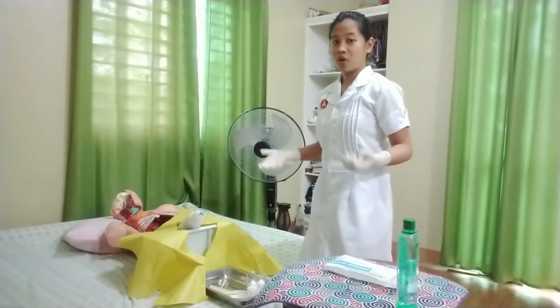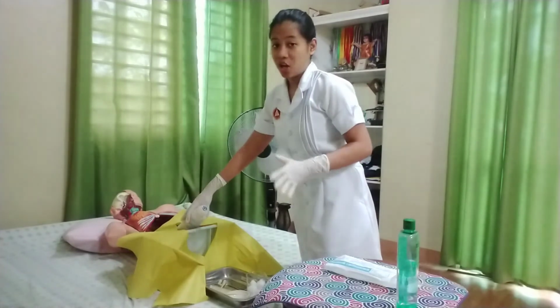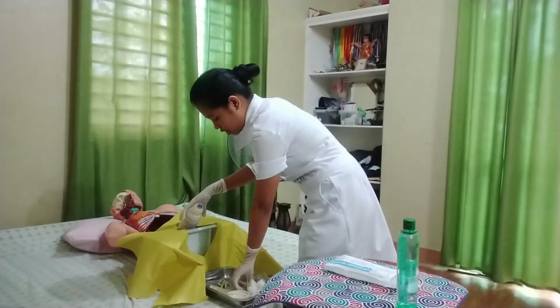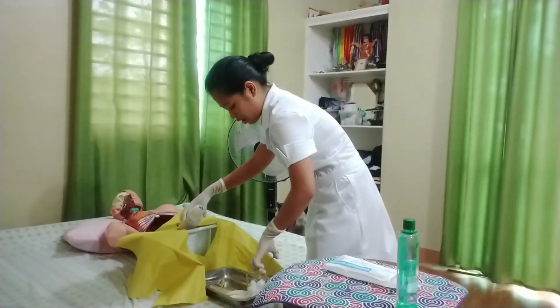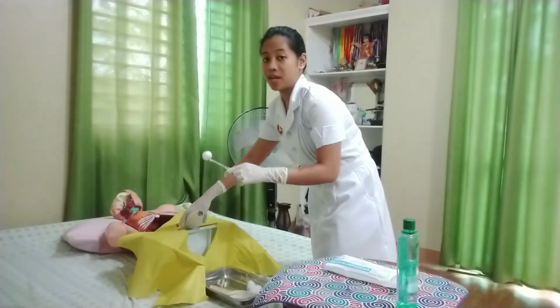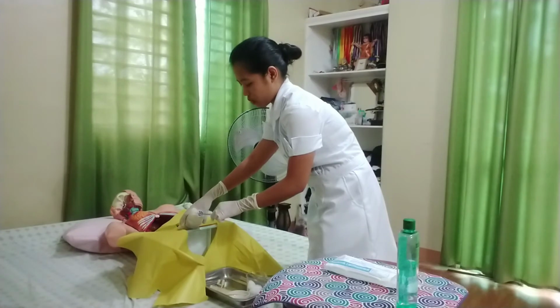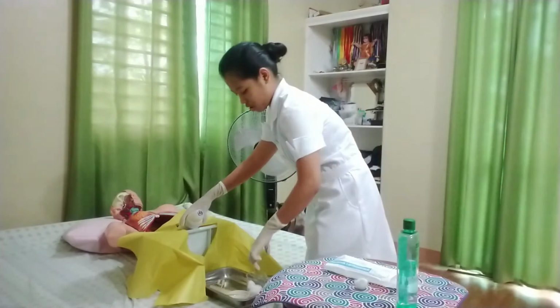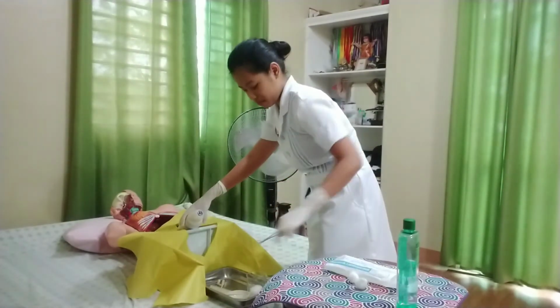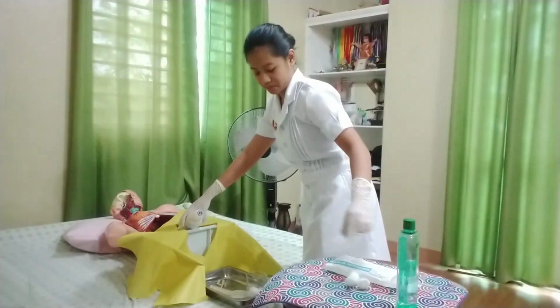Assuming that we've done all the first procedure, I will now lift the penis using my non-dominant hand, which is already considered contaminated, and using a clean cotton ball held by the forceps, I will be cleaning the area at the meatus. I will start from the meatus downward to the base of the penis for 3 cleansings. So let me start. I will use a circular motion and then discard it. And then the other one. Discard it. And for the last one, we will discard it.